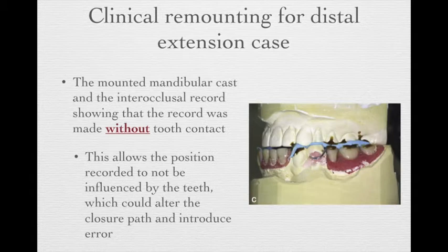Remember, when we do a removable prosthesis, we will likely use the centric relation. So when the centric occlusion happens in centric relation, that relationship is controlled by the centric relation. And which part controls the centric relation? It's not the tooth, it's the condyle and disc relationship. So once you are able to get the centric relation, even if you have some space between the upper and the lower dentitions and the partial dentures, that relationship is still accurate.